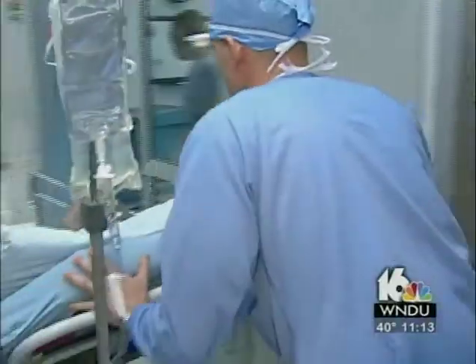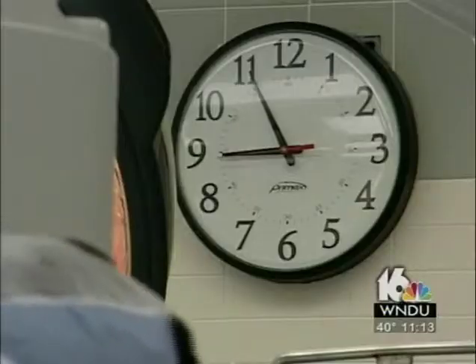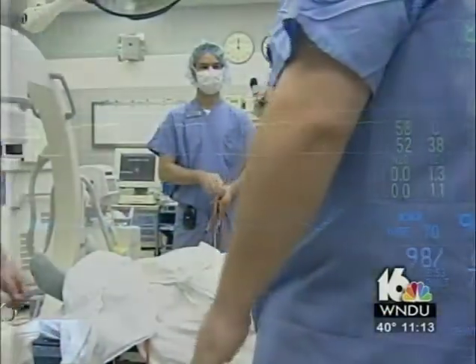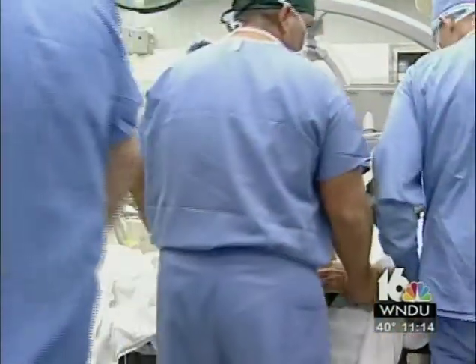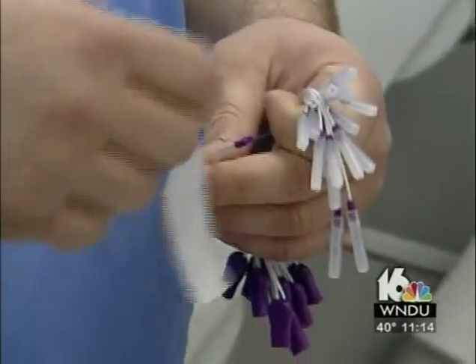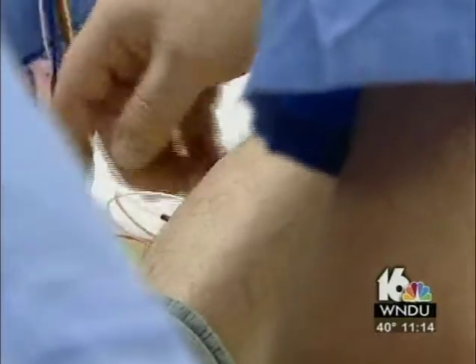It's the moment of truth, and we all suit up for surgery. Dr. Mango and fellow surgeon Annette Smith scrub in. Surgery will take about 2 hours, and Dr. Mango and his team get George positioned. You want to go ahead and grab his arm here for me? I'll go ahead and start putting his needles in. Needles put in to monitor George's nerves, plus a couple of extra just as grounds, and that helps keep us safe.